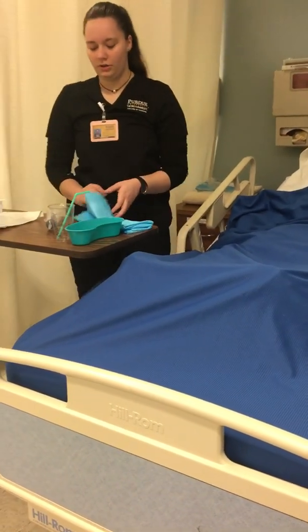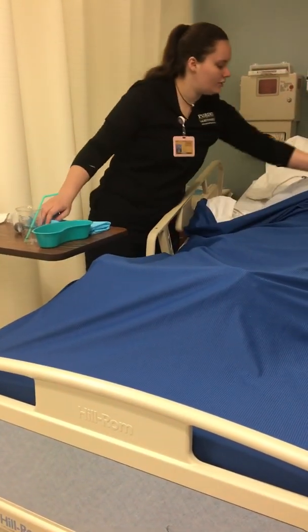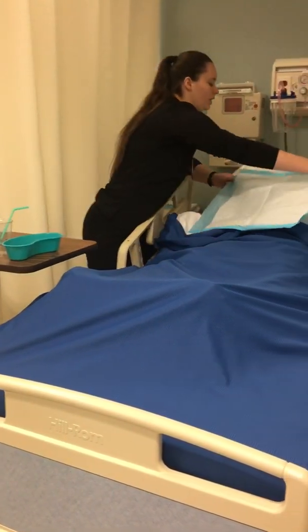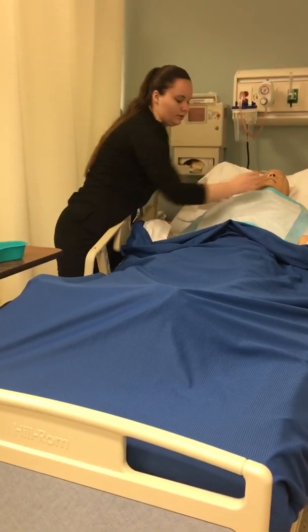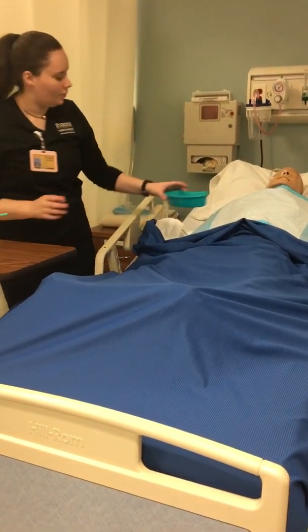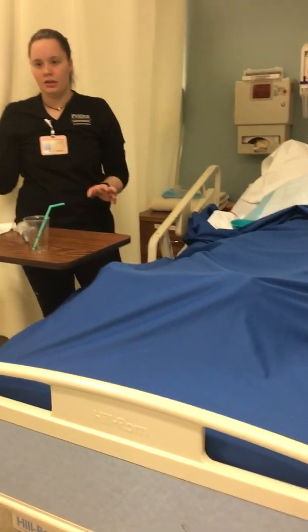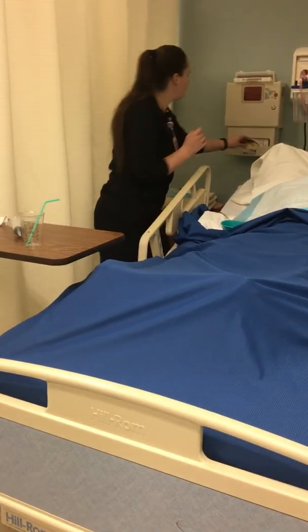I'm going to uncover the patient just a little bit. I'll place the drape nearby because they might gag a little bit when the tube is coming out, and have the bowl next to them. Then I would put on some gloves.